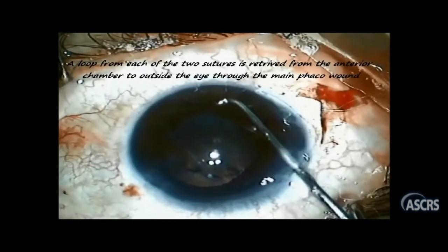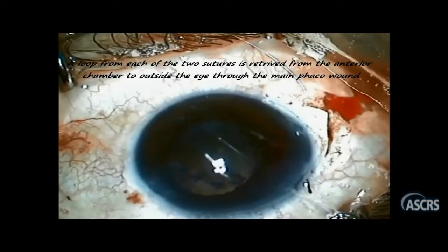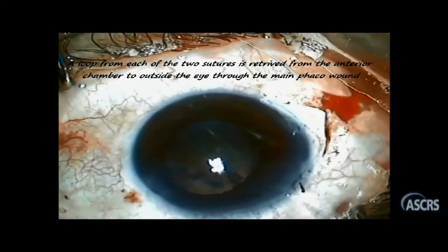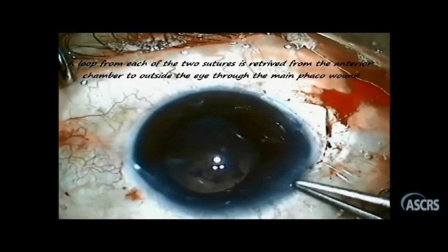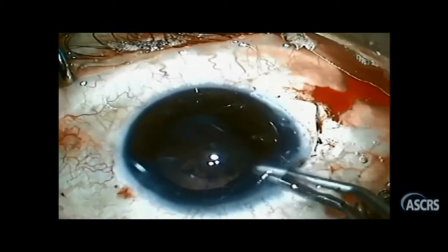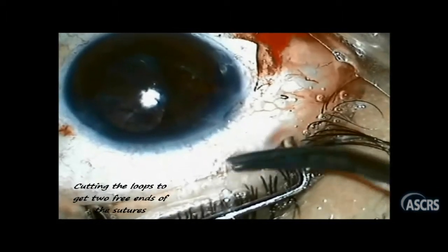A loop from each of the two sutures is retrieved outside the anterior chamber through the main wound, and then these two loops are cut. Now, after cutting the two loops, we have four cut ends to tie and eventually secure the iris — two ends coming out from the main wound, and another two ends coming out from beneath the scleral flap.